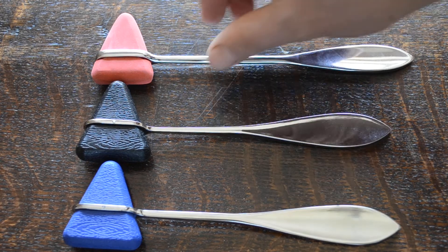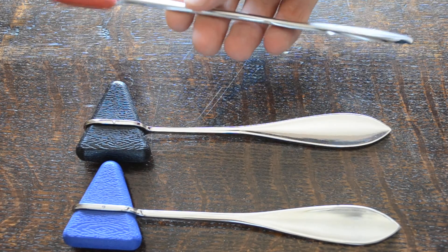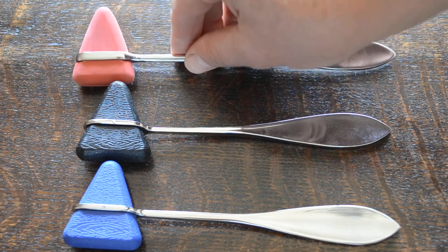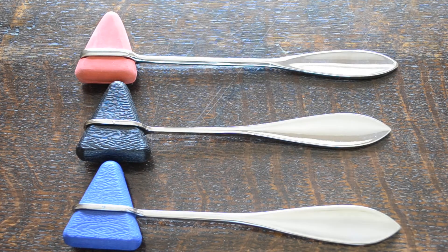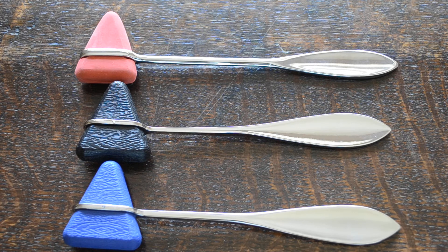My personal recommendation would be the rubber-headed classic 20 centimeter unit just because you've got the added advantage of being able to take the head out if you do want to polish it up or keep it clean. So they're all available from the Valumed website.